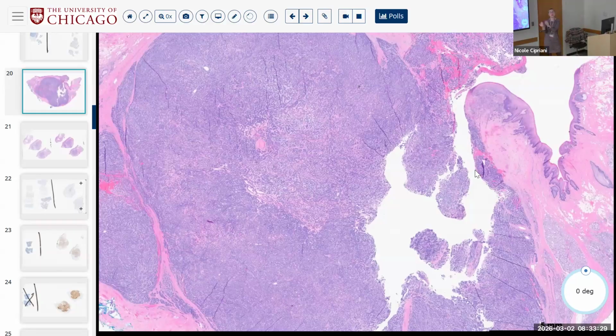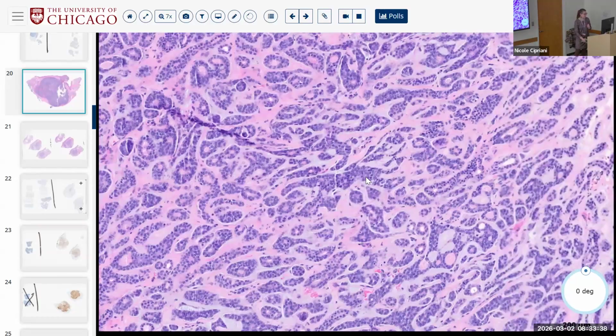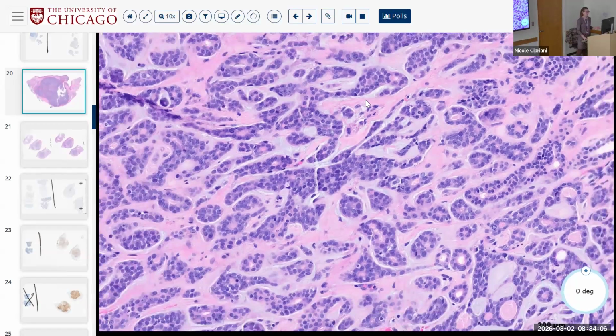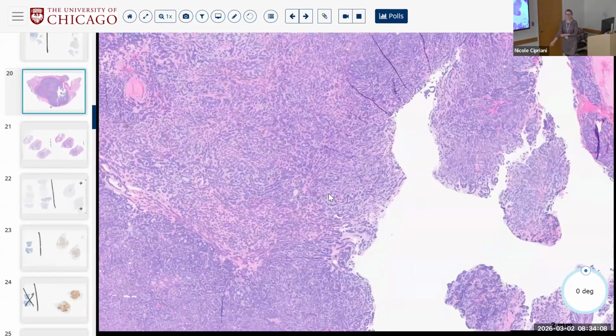So mostly our biopsy is correlative, but sometimes the cells are scant. Sometimes the problem with salivary, right, is that even if the cytomorphology of the cells is bland, the biologic behavior can sometimes be unexpectedly aggressive for the cytomorphology of the cells, right? If it's overtly high grade, necrosis, mitosis, and so on, that's helpful, right? But sometimes it can still be cytologically bland and still be biologically aggressive. So that's the problem with salivary, to be honest. One of the problems.